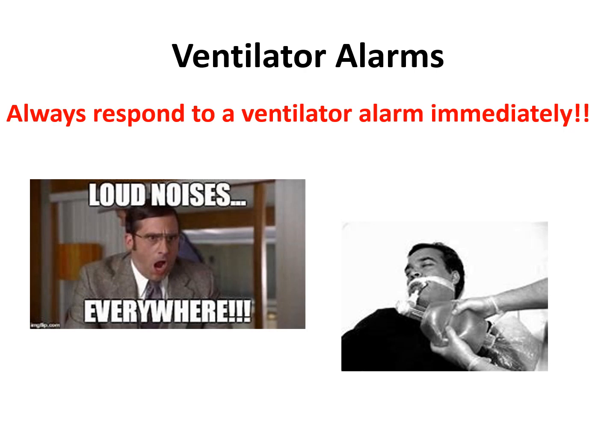Let's talk about those ventilator alarms. We cannot stress enough that you always respond to a ventilator alarm immediately. You want to treat that patient, okay? If ever in doubt of what's going on, or you don't understand why it's alarming, disconnect the patient from the vent and start bagging them with oxygen with the ambu bag while you're waiting for the respiratory therapist to come. So go attend to any ventilator alarms.